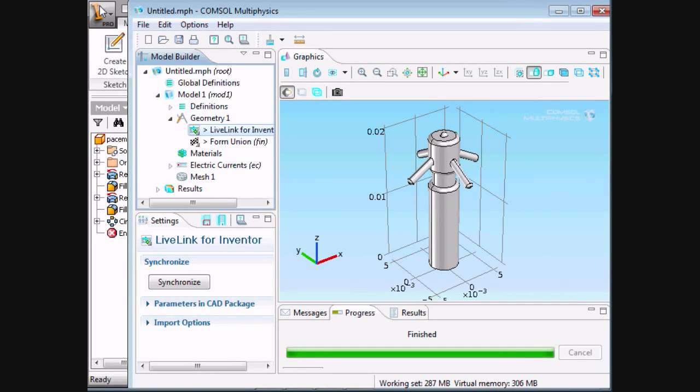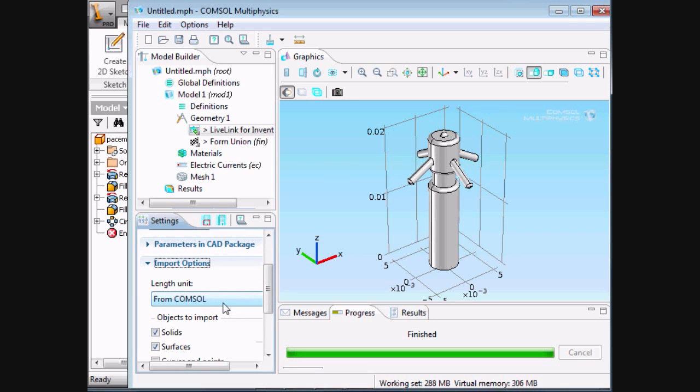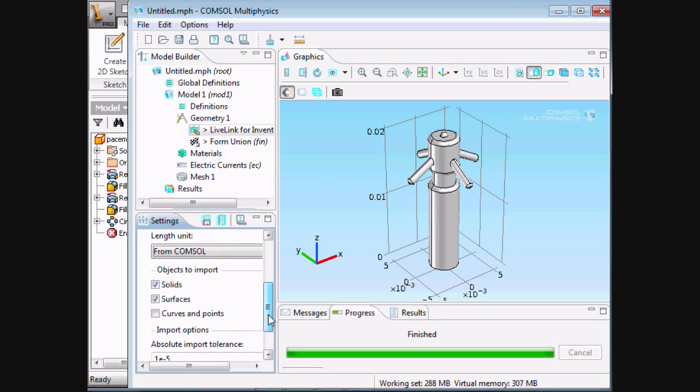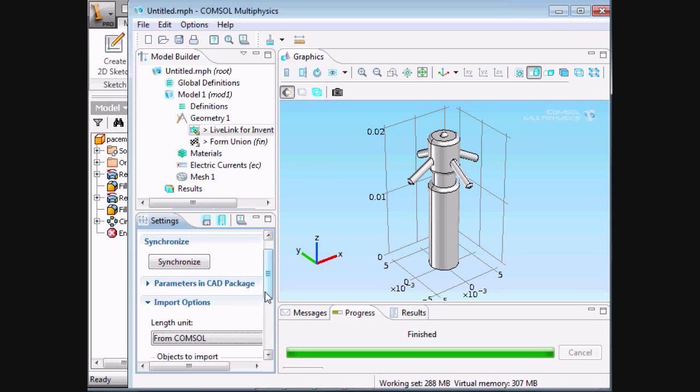When we perform a synchronize with LiveLink, there are different options we can choose from. The very first one is to select the length unit. We can choose to use the default unit as it exists in COMSOL, or choose to use the source unit in the CAD document. We can then also choose which objects get imported, the solids, the surfaces, or the curves and points. Finally, we can set a tolerance, check the imported objects for errors, and then choose whether to automatically repair them or not. LiveLink is a bidirectional interface.